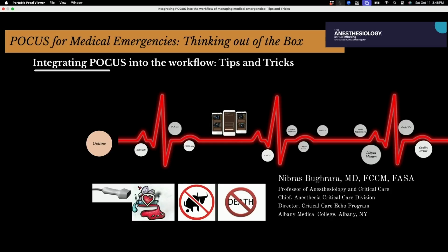The other thing is there are a lot of cultural issues. For instance, we battle cultural issues with the nurses using ultrasound during cardiac arrest and physiologically difficult airway. We started including them in our simulation, because before that we were getting a lot of pushback. Every time we do it, we invite 2 or 3 nurses, and they felt empowered. For instance, they have the power to stop the residents within 10 seconds. If the resident is trying to get the image and it takes longer than 10 seconds, they have the power to say, okay, let's stop now. So there are a lot of problems, but I think one thing is having a structured approach where all the images are saved for QA, lowering the entry point in a safe way.